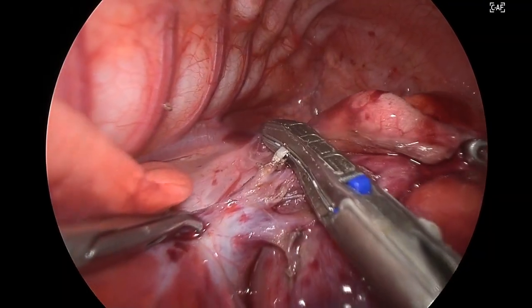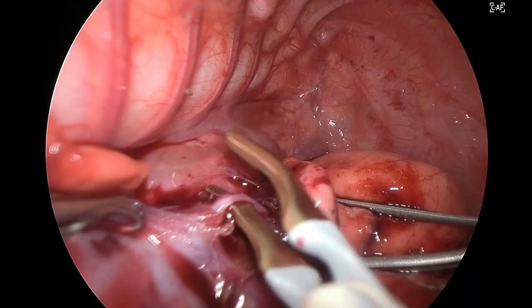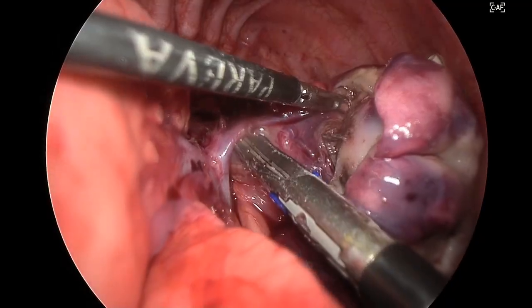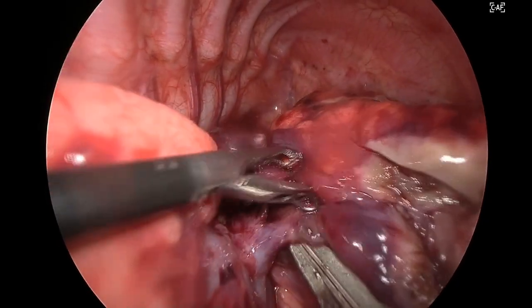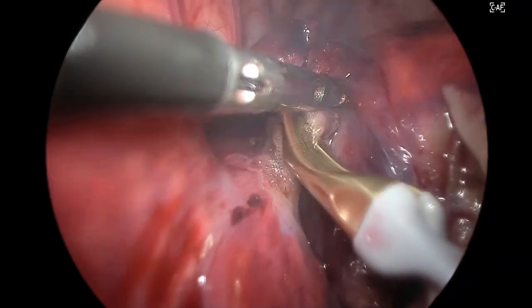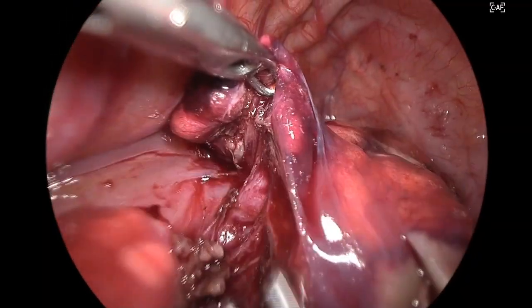So these tributaries are then sealed and divided, not using a hemolock for these vessels. These are too small and can be managed with sealing. So using a biclamp now just to seal the device and then divide, and this is the last tributary that we could see, which has again been dissected and will be sealed and divided. One problem in tackling the vein first is that the arterial supply is still on and the lung becomes congested, and there's some oozing. As we can see, there's some degree of oozing, although there's no definite bleed.